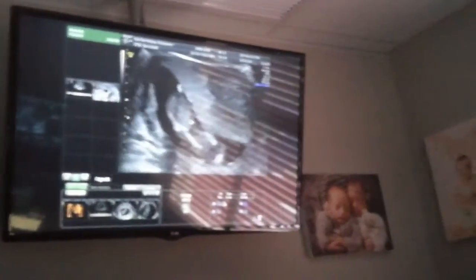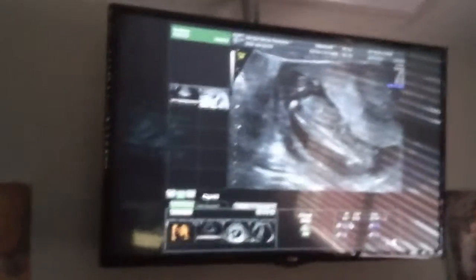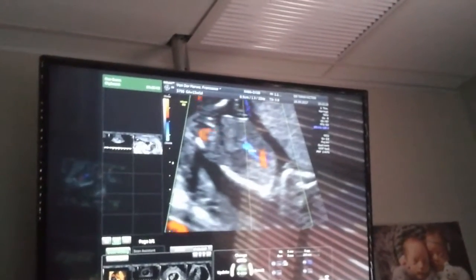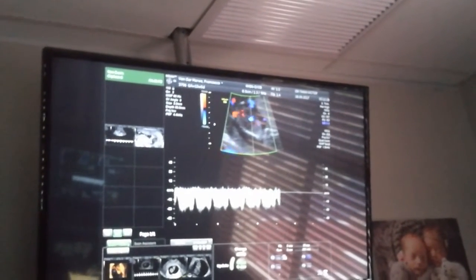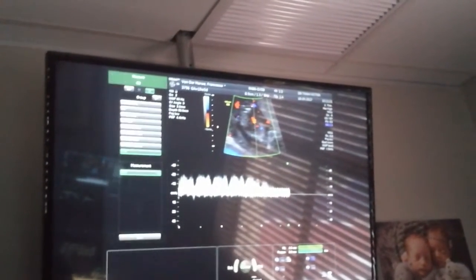I can't believe how much it moves around here, it's crazy. Look at the spine. This is what we call the ductus — and this is a perfectly normal curve for a non-Down syndrome baby.